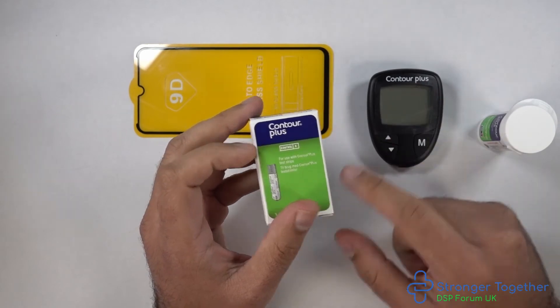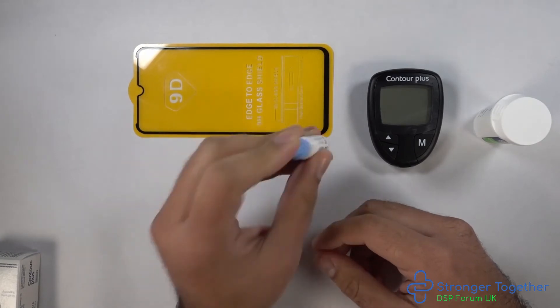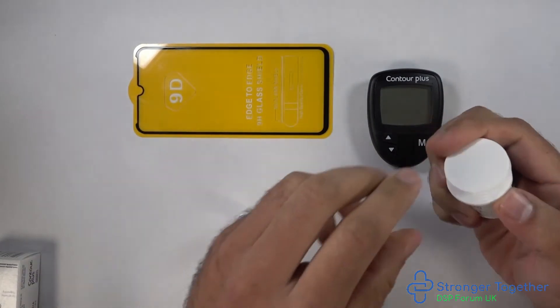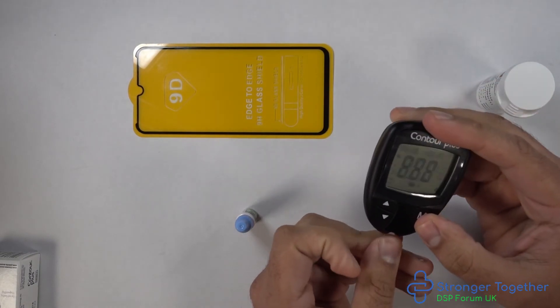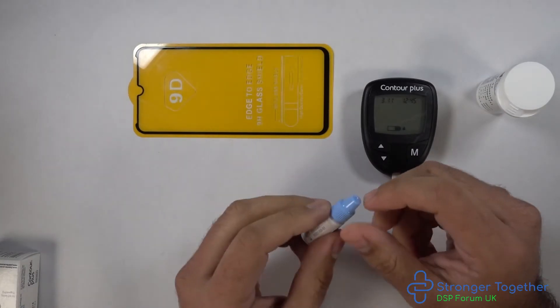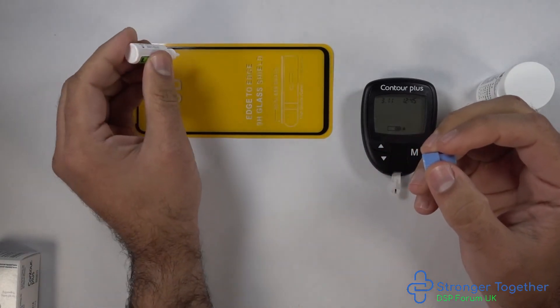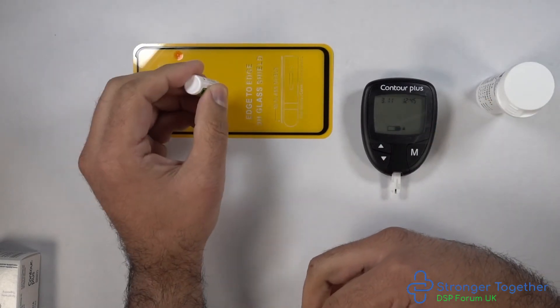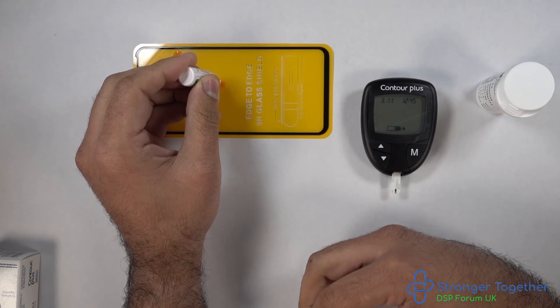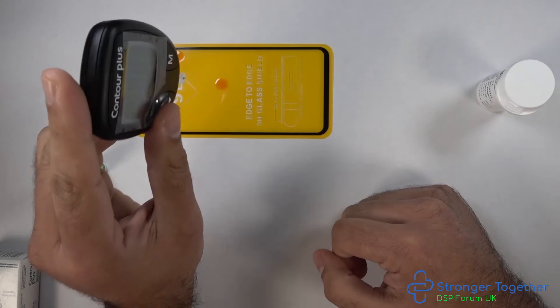Now let's get into the testing procedure. We need to gently shake the control solution first. Then insert a glucose test strip into your meter — you'll see an icon on the display with a flashing blood drop. Open the control solution bottle and gently squeeze a drop out. I squeeze one drop and then another, using the second drop. Touch the window of the glucose test strip against the solution and the test strip should automatically take it up.